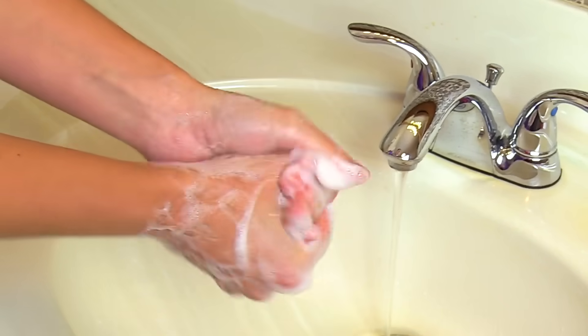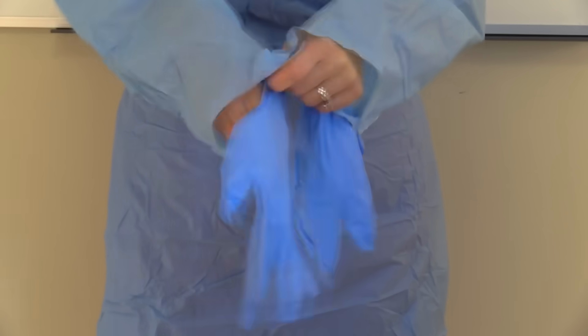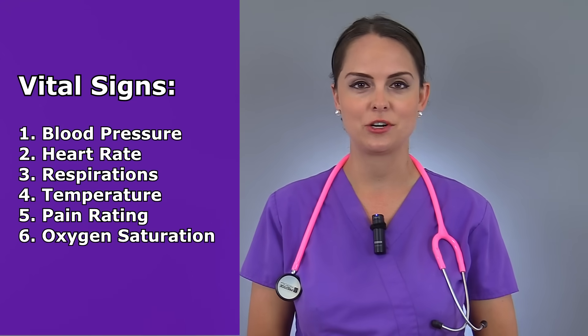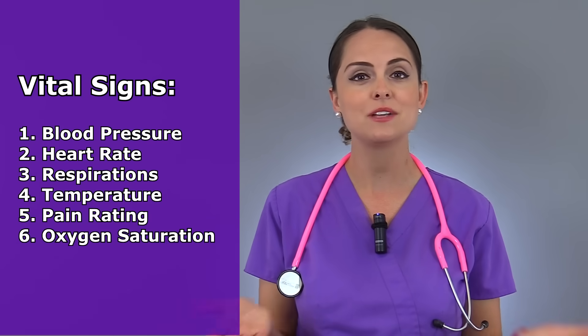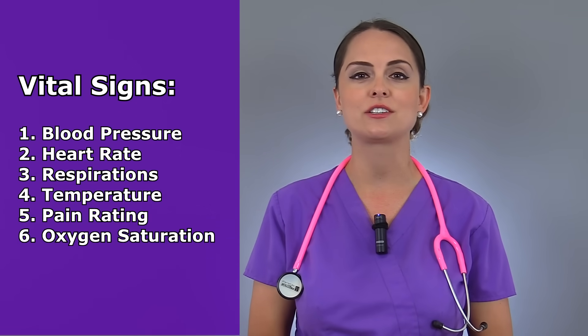Then you want to perform hand hygiene and don the appropriate PPE if necessary, like if your patient's in contact precautions. Now, what is collected during the vital sign measurement? You'll be checking the patient's blood pressure, heart rate, respirations, and temperature. In addition, you'll be asking the patient their pain rating, which is sometimes referred to as the fifth vital sign, along with collecting their oxygen saturation.